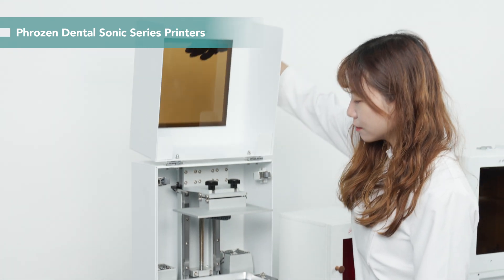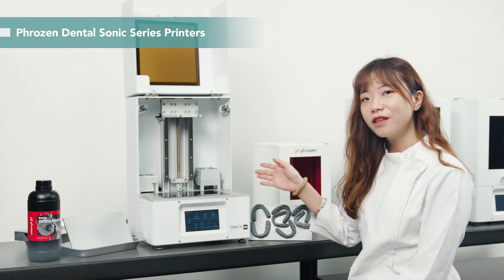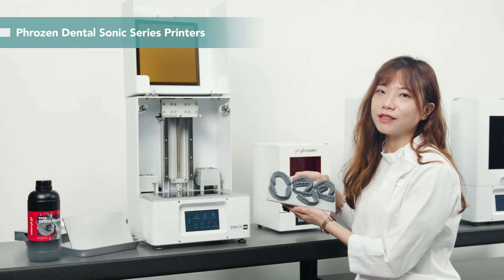Let's move to the printing step. This is the FrozenDental Sonic series printer. With it, we can print up to 8 aligner models at a time.